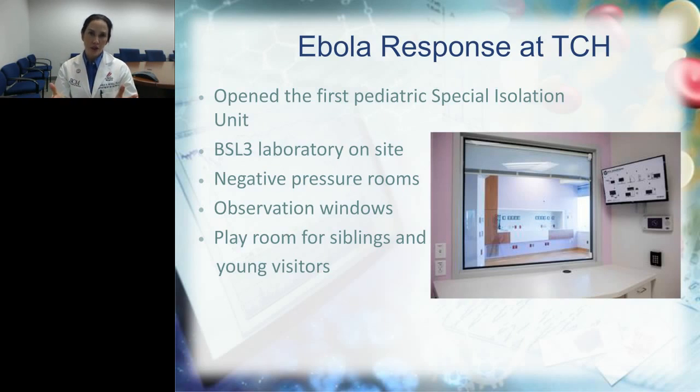And there is a BSL-3 laboratory, which means that we have the capacity to work with pathogens. You don't want to be growing Ebola, obviously, it's a BSL-4, but in terms of detection, working, whether it's TB, whatever the case may be, we do have a specialized dedicated lab immediately adjacent to these rooms.